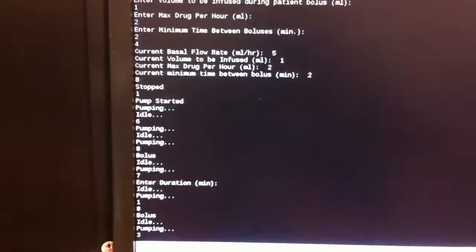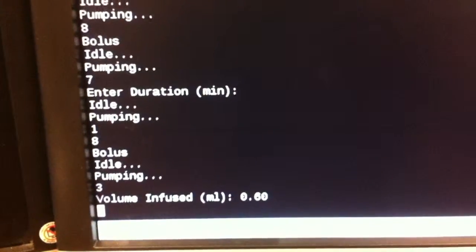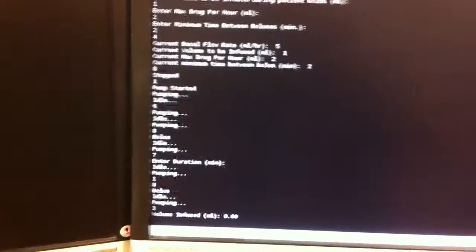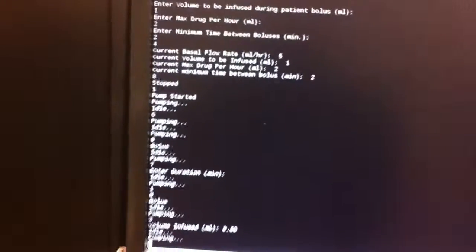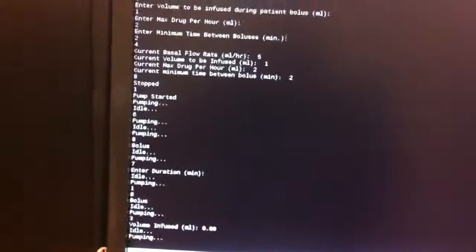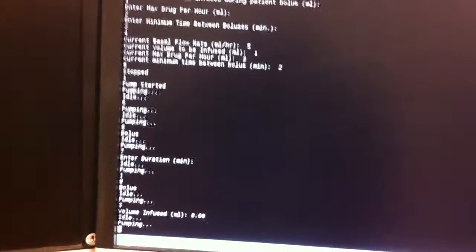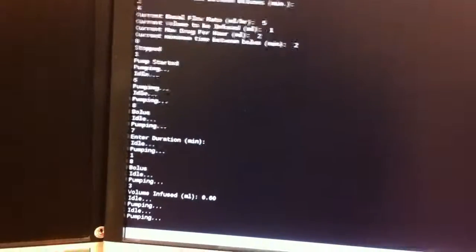So here also you can check how much drug was infused, and this is 0.6 milliliters so far. So the patient bolus should take around 2 minutes, and after that it should switch into a clinician bolus. And what's more, during the patient bolus the basal flow rate is maintained, which means that the patient bolus is some sort of addition to the flow rate.